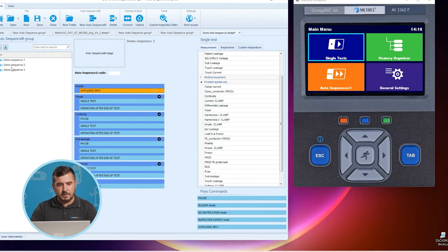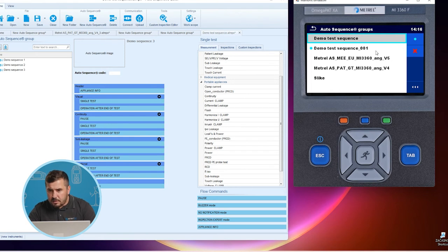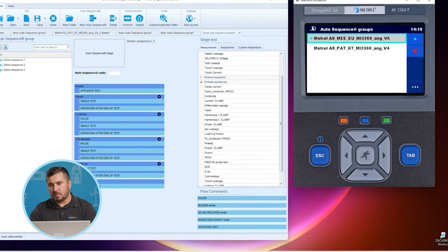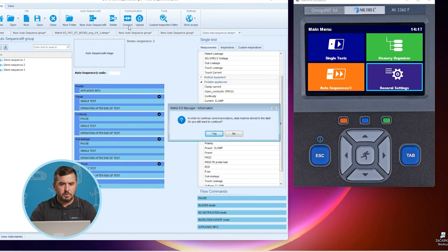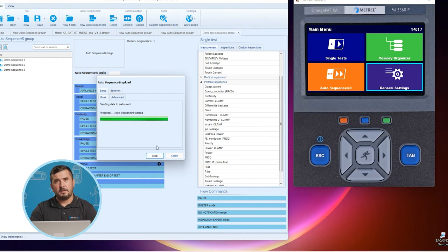Now we have created three different test sequences which we will upload to our simulator. First we check what sequences are already on the simulator and delete some so we won't be confused. Now the simulator contains only two official auto sequence groups from Metril. We add the additional group we just created using the Upload option, proceed with Yes, select the appropriate COM port — the serial port emulator — and perform the upload. Being a short auto sequence group, it uploads quickly.